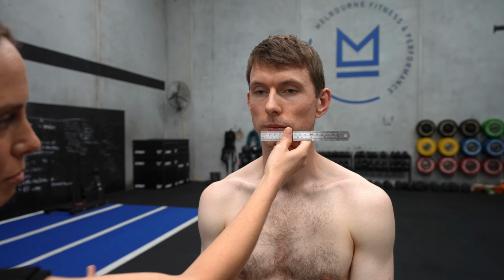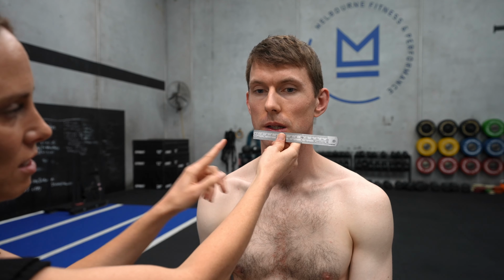Exactly the same with laterotrusion. So if we're measuring from the side and he's starting at 2 mil off to, for example, the left, when I measure him going to the right, I want to do, let's say, 10 mil plus the 2 that he's starting from, because I'm just measuring from his 0, but he's not starting at 0.